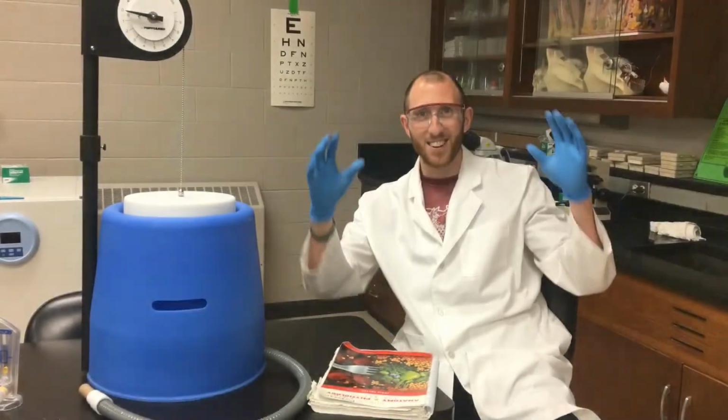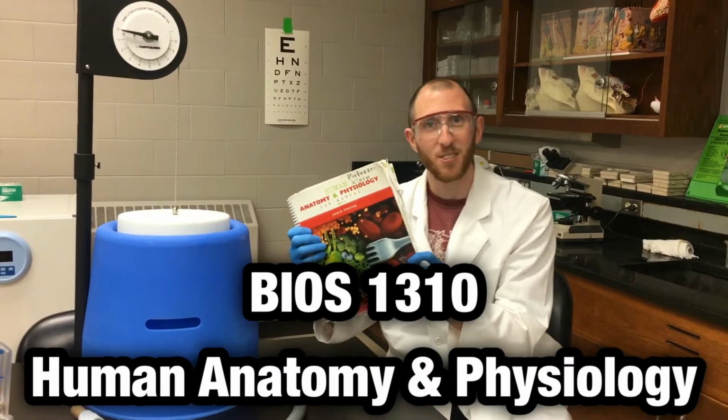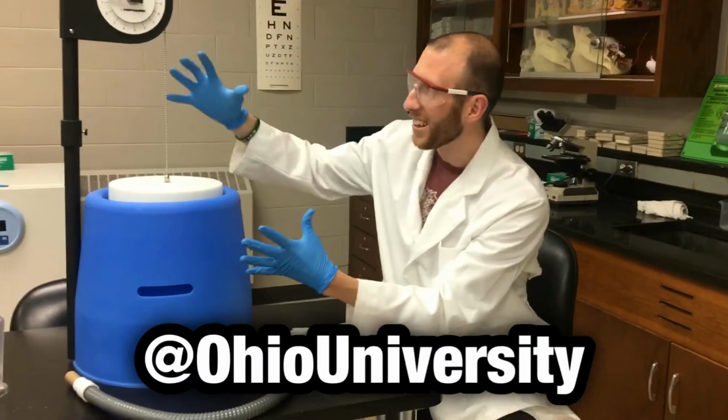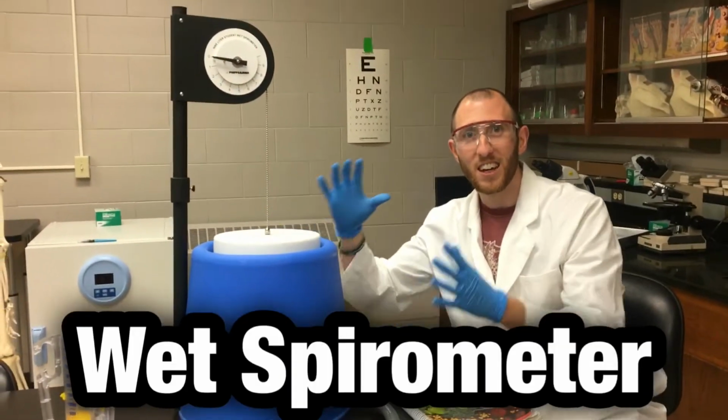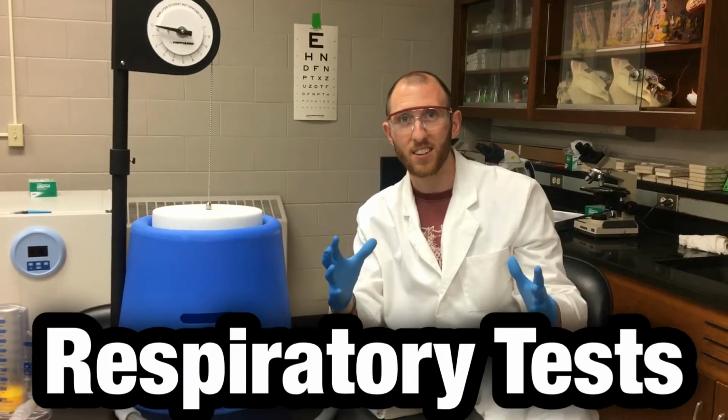Welcome back to the BIOS 1310 Human Anatomy and Physiology Lab at Ohio University. Today we're here with the wet spirometer and we're teaching different respiratory volume tests.